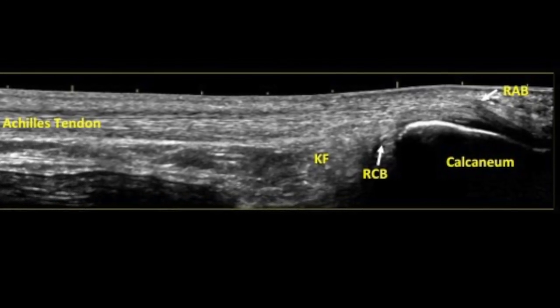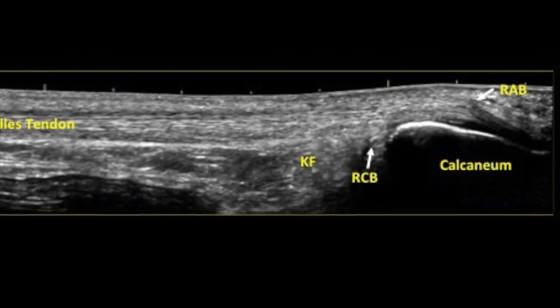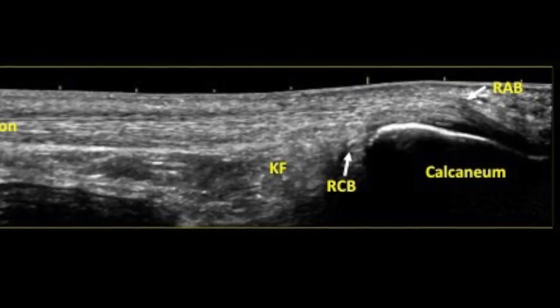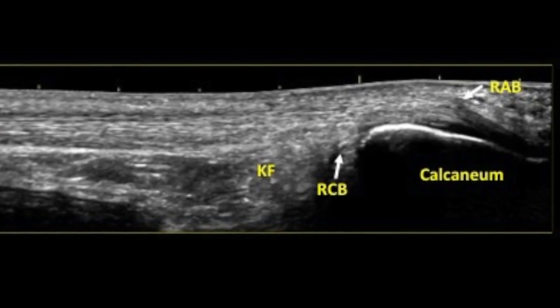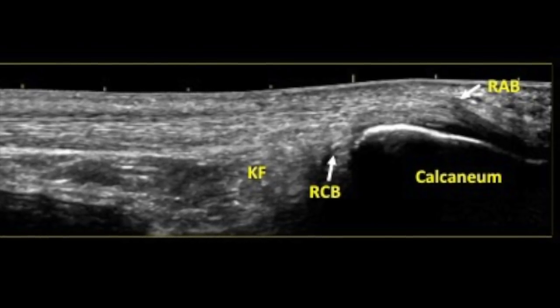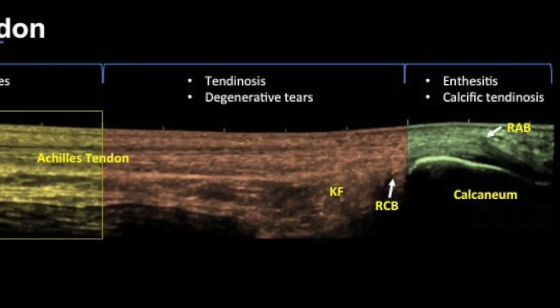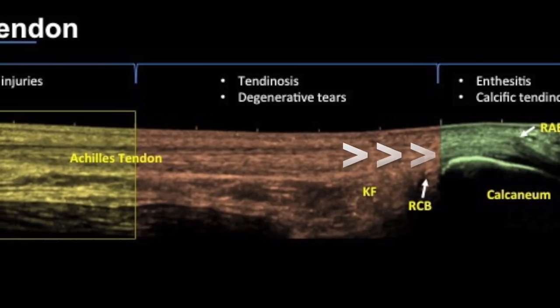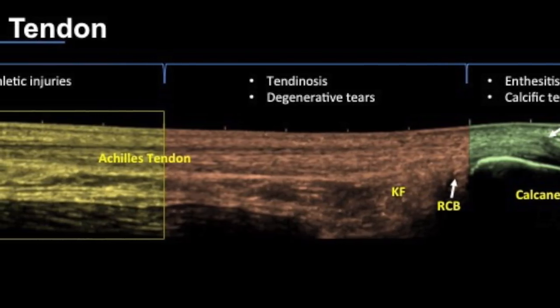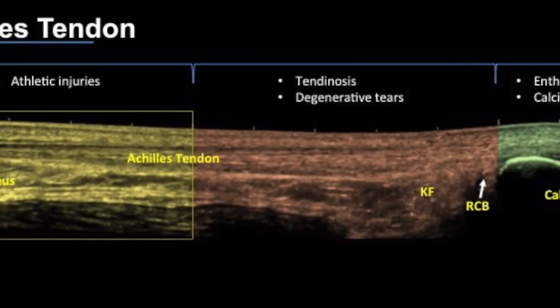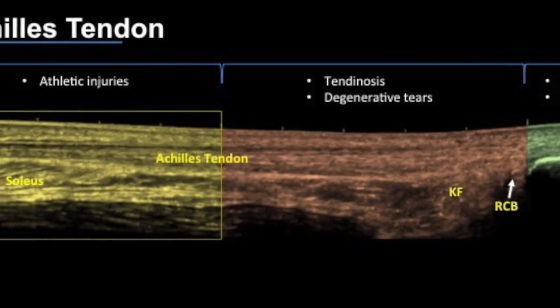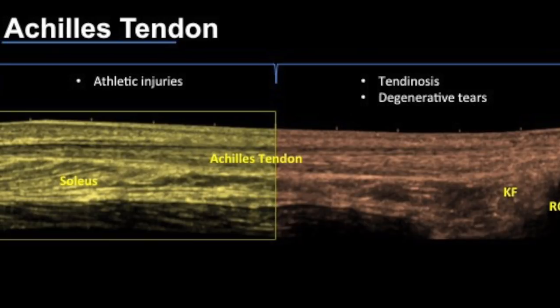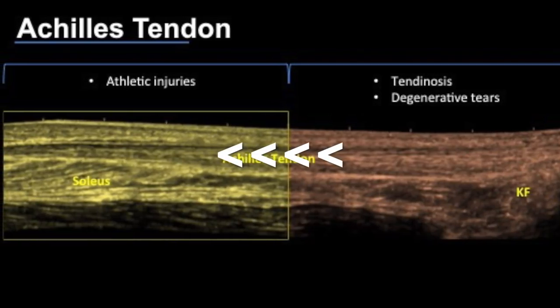In one extended field-of-view section we can see the calcaneum, the insertion fibers of the Achilles tendon, the main tendon, and the myotendinous junction. The tendon has three broad segments: the peri-insertional area where most enthesitis and calcific tendinosis occur; the critical zone, which is two to six centimeters proximal to the insertion where most tendinosis or degenerative tears occur; and proximally at the myoaponeurotic junction where athletic injuries happen.